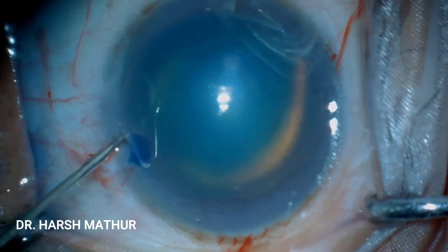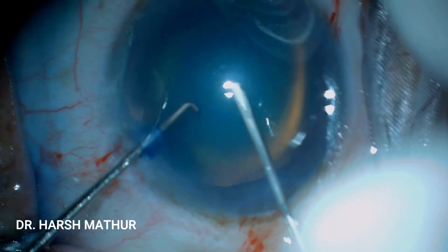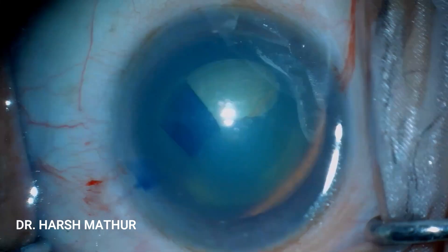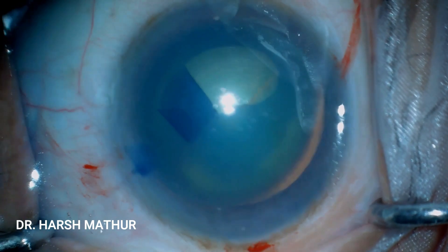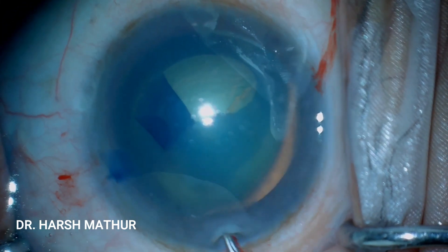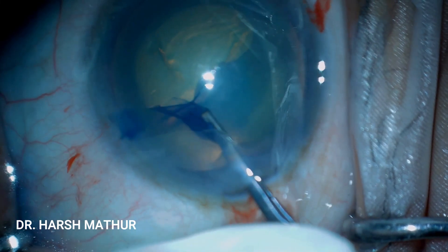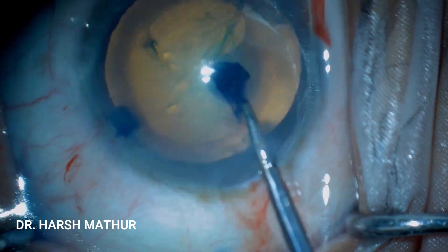A 5.5 mm mark has been placed over the cornea, which will help guide the rhexis. A flap is being made by the cystotome. The rhexis will be done by a Utrata forceps, which gives better control. The key is to float in the incision and not press the lower lip so as to prevent leakage of the viscoelastic substance.